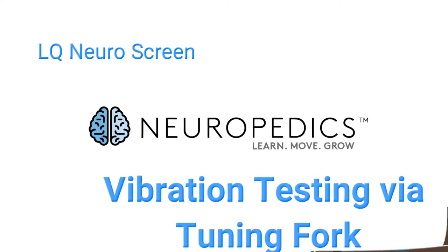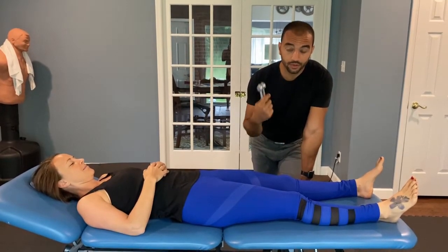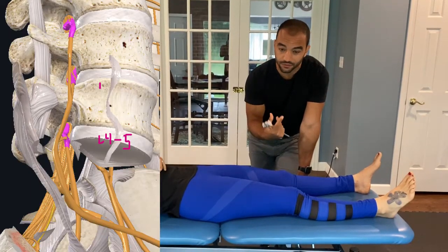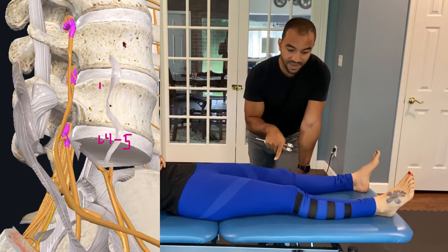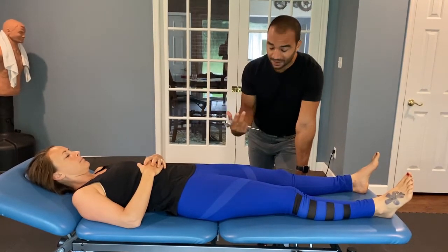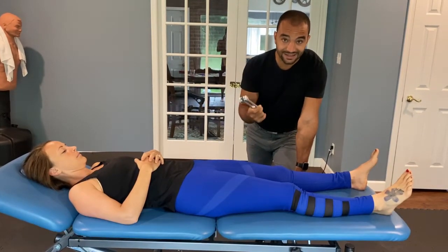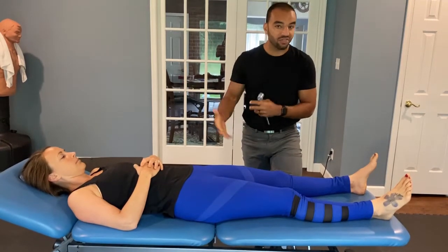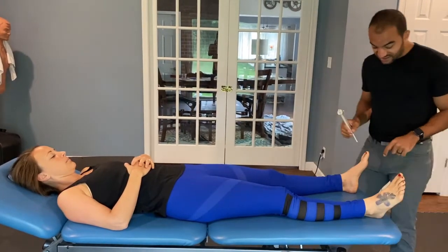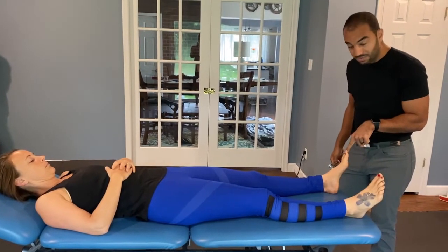Okay, so this is a neuro screen for the lower quarter. If we are suspecting some type of posterior lateral disc herniation that's affecting the nerve root, and we're getting some painless weakness in myotomal testing, and we have a subacute or acute low back pain coming in, the tuning fork or vibration testing is a very sensitive test to pick up on if there is any type of pathology in the nerve root in the lumbar spine. So we're basically going to test their ability to pick up on vibration at the very distal part of the hallucis, or the big toe.